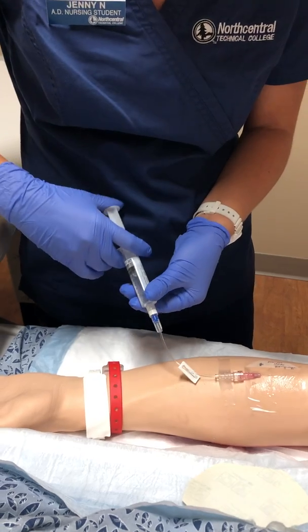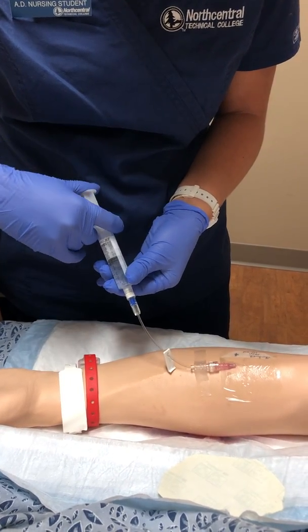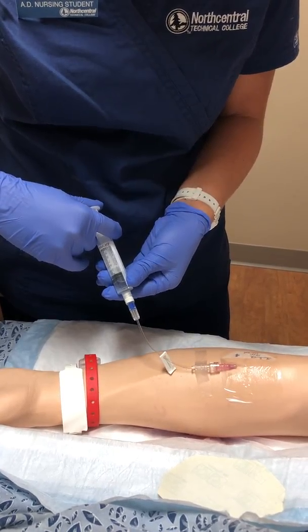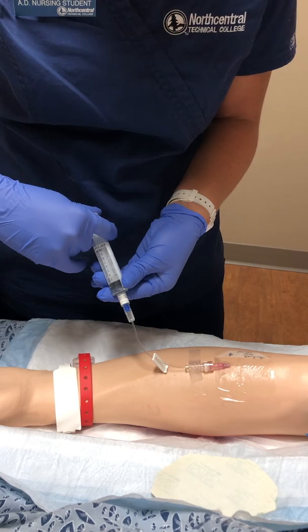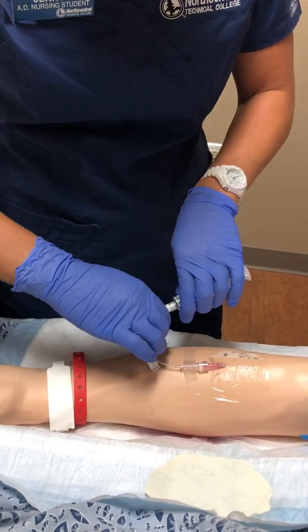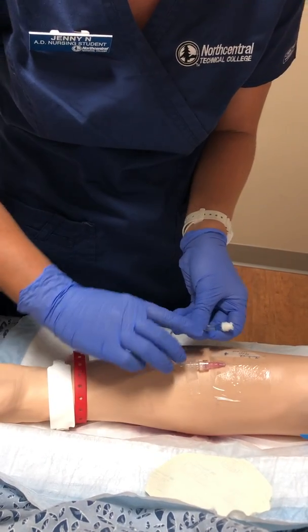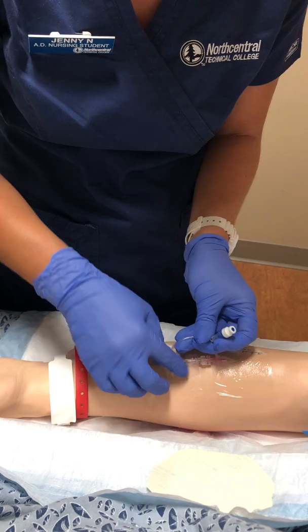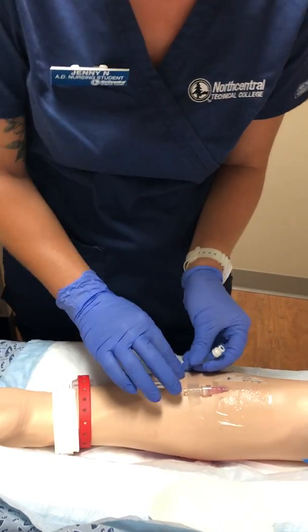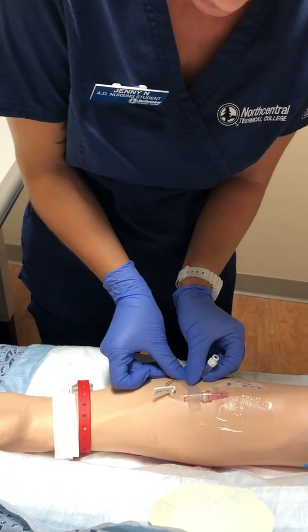I'm going to finish flushing. And I'm flushing with 10 mils of normal saline. How are you doing, Mary? And she says she's doing good. Very good. Got it all flushed. I'm going to disconnect, and I'll put that in my trash pile. I'm just going to clamp this right here. And I'll tape that in place so it's not flopping around everywhere. It just kind of keeps it more secure.